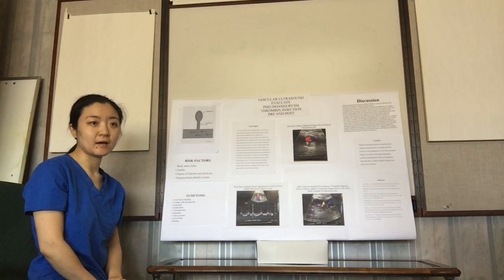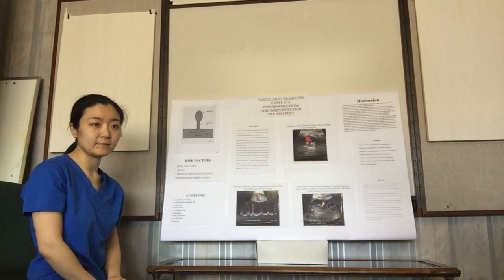The diagnostic ultrasound performs an important role in evaluating the pseudoaneurysm. It reveals the blood flow waveform in the pseudoaneurysm. Color flow and spectral Doppler were present in the study to demonstrate the condition of the pseudoaneurysm. We can see the diagnostic ultrasound makes a valuable evaluation and helps doctors make a correct decision.